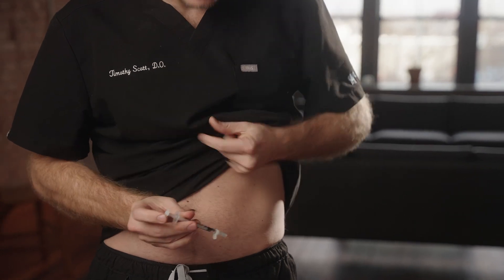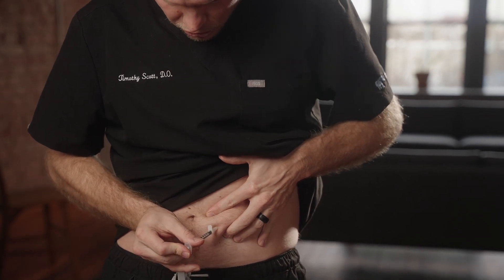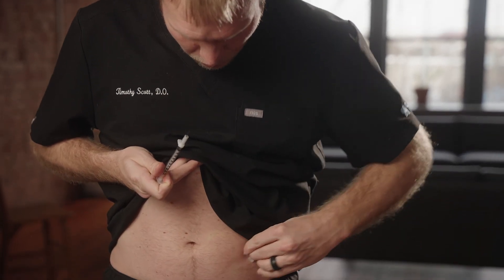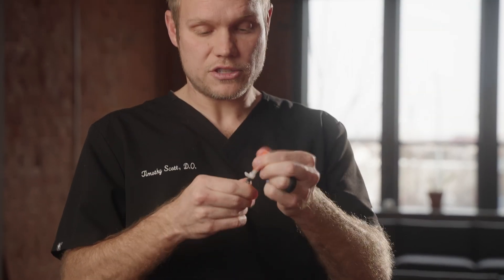It kind of takes away any of the little sharp poke. Go ahead and pinch a little bit of fat, put your needle in, and go ahead and push it all out. Pull out, and I usually just give it one last little wipe, put my safety cap back on, and I'm done. Some of these syringes, you don't have to put the safety cap back on — you can just retract it like this when you're done as well.